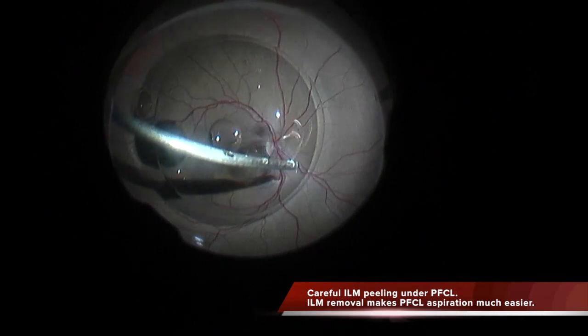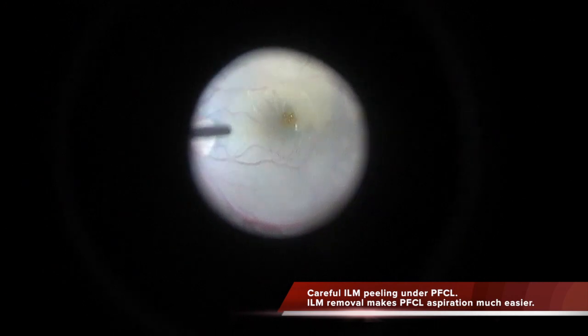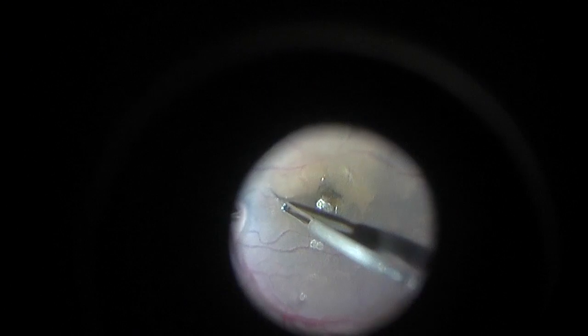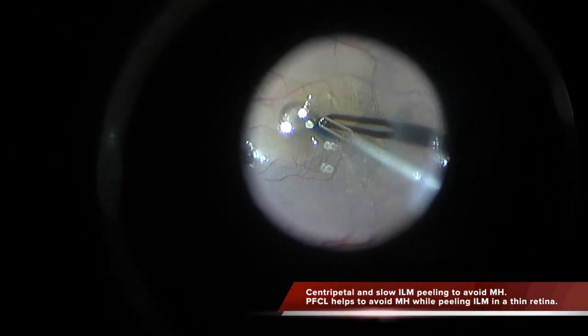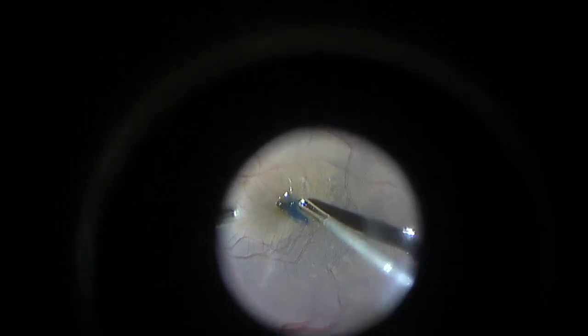To do this, initially we perform ILM peeling under PFCL to remove the ILM without the risk of inducing a macular hole due to very thin peeling in the inner retina at the foveal area. The peeling is centripetal and afterwards it is enlarged centrifugally towards the arcades.